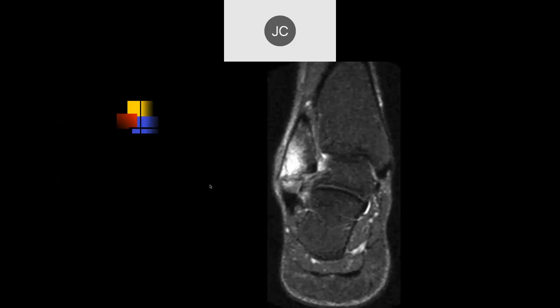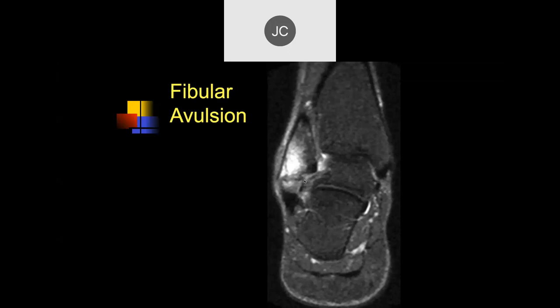There's a transverse avulsion fracture of the distal fibula during an inversion-type injury to the ankle. You need to assess the usual ligaments, and which other bones are involved depends on the amount of rotation and torque at the time of injury. There's so much variation in ankle motion that injuries can be quite variable depending on the details of forces and ankle positioning at the time of injury.